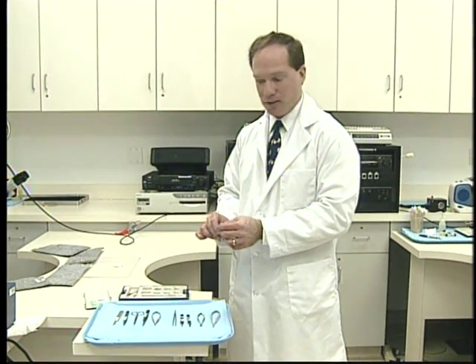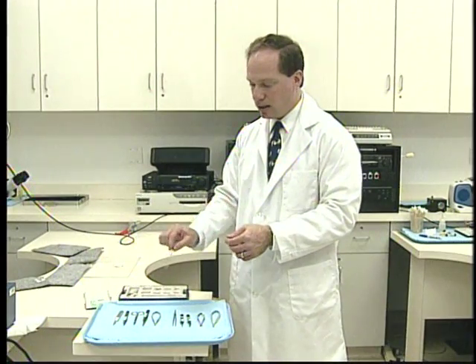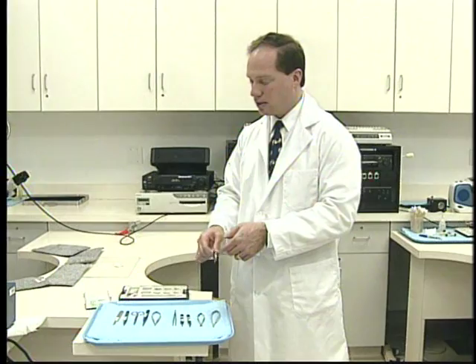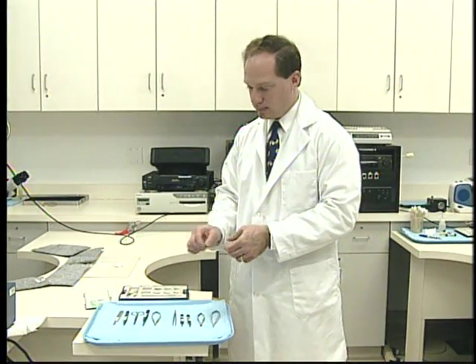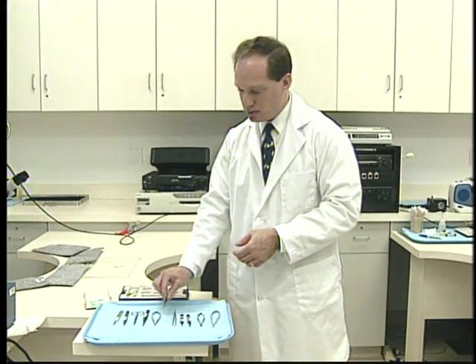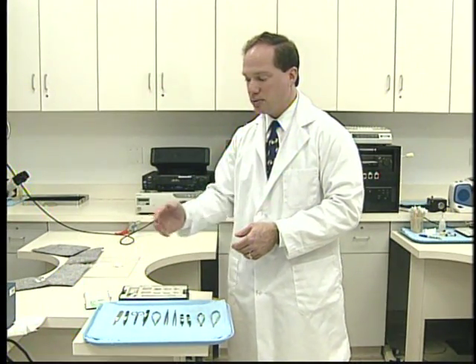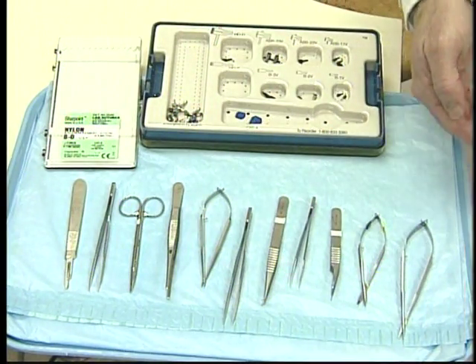So it's very important to take extreme care when handling these instruments that you don't knock the instrument tips into one another or drop them on the floor or carelessly throw them at the scrub nurse hoping that they will catch them, because these are expensive instruments and you like to go through as few as possible. Now, let's review the various instruments that we have to work with for training purposes. These are the instruments we will be using.